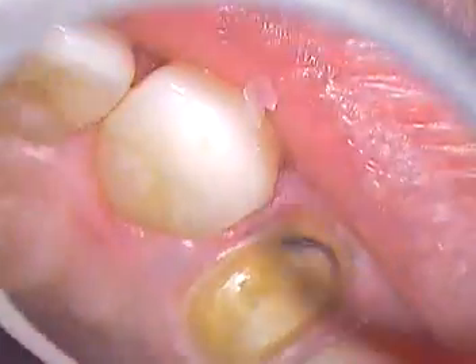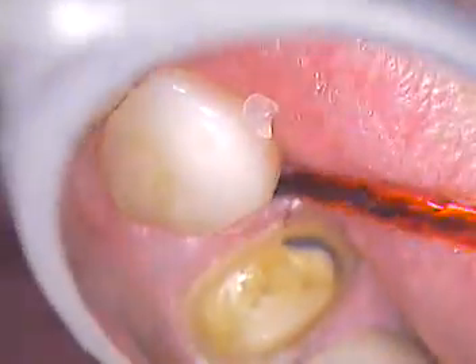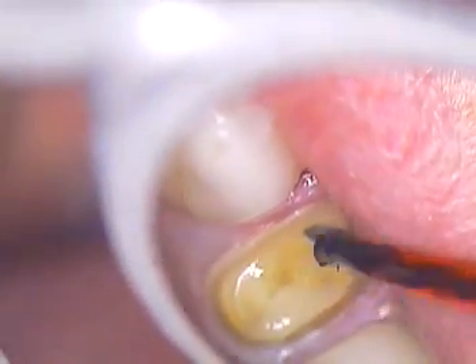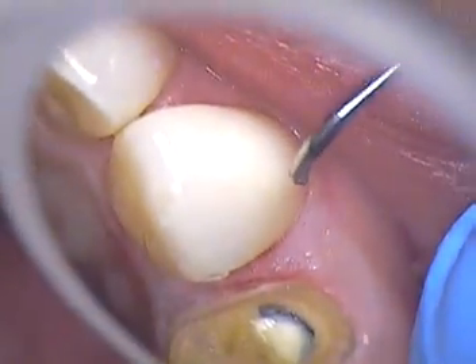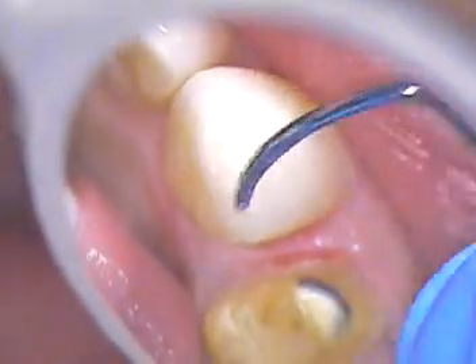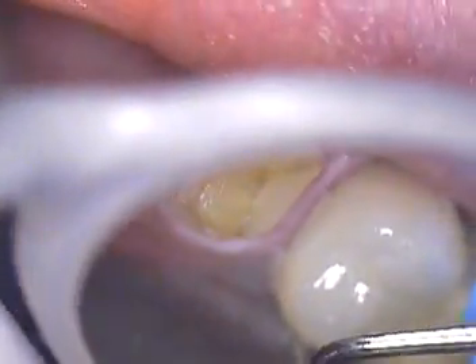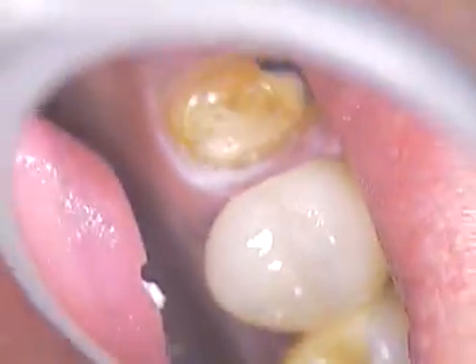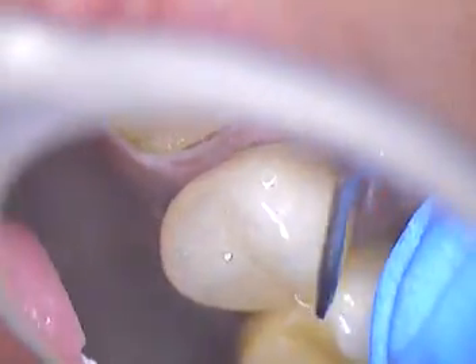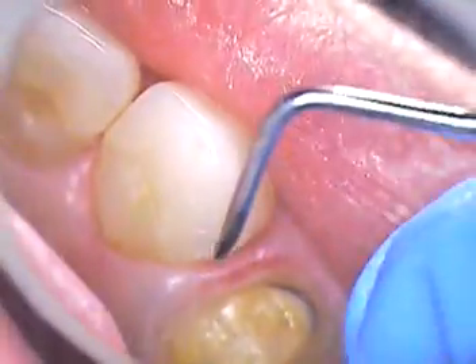We're going to take Consepsis again — suction the lingual. What we're going to do is look for composite material that's invisible, that you can't see. A little bit got up here on number six, a little bit got next door, a little bit got over here — sometimes it travels between teeth. If you forget about all this you'll have problems. The rules also apply to the lower — you might have some composite that goes down to the bottom teeth, so while we're up here we'll scrub it thoroughly.